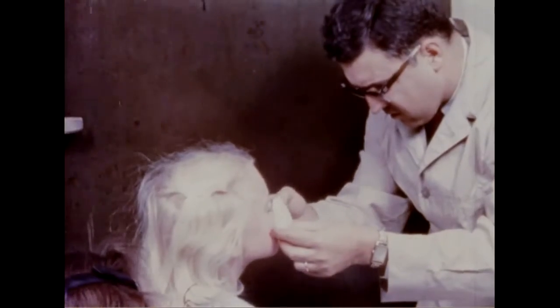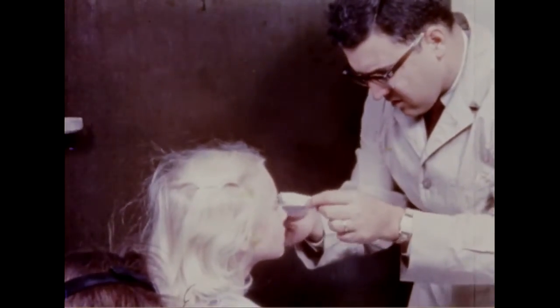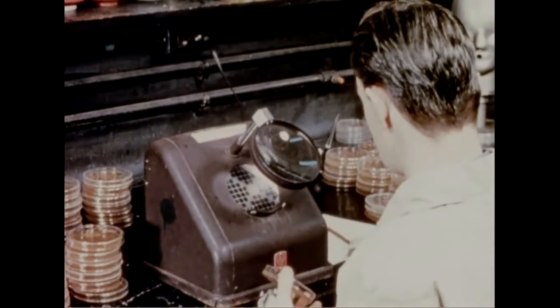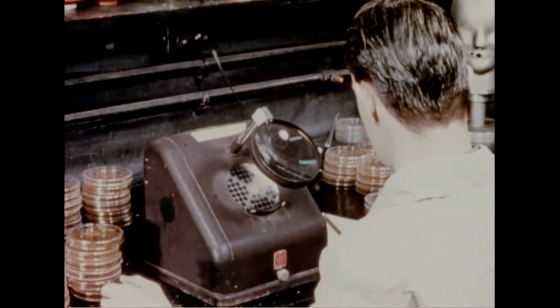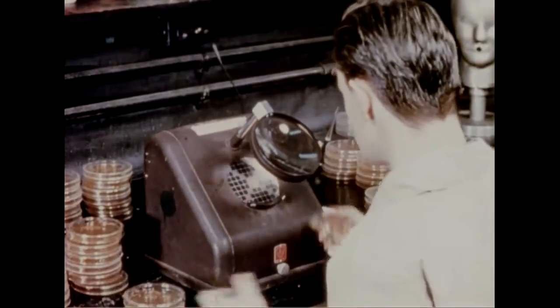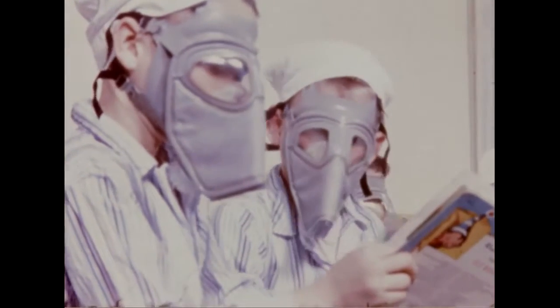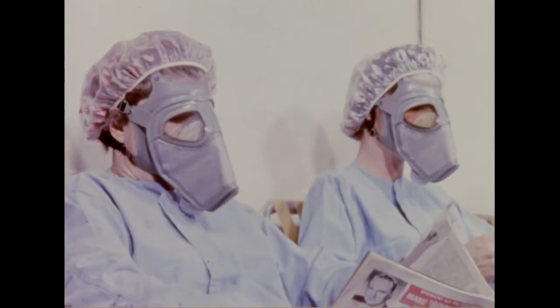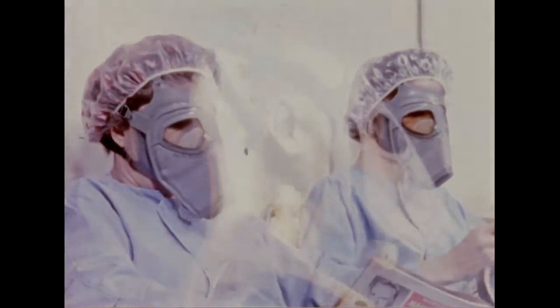The filter samplers are collected for laboratory assay to determine how many organisms had penetrated the mask. Results indicated that a satisfactory fit had been obtained for each of the volunteers and that the 6 mask sizes would meet all civilian needs for defense. As all sizes effectively screened out the test organisms, the masks prove they are a thorough protection for men, women, and children. The masks will cost no more than several dollars.